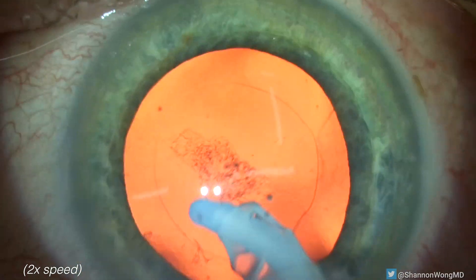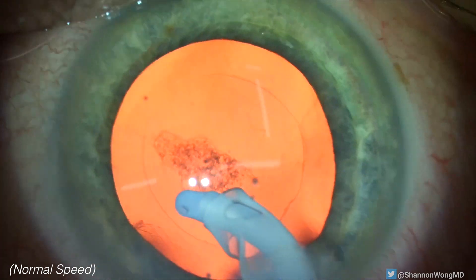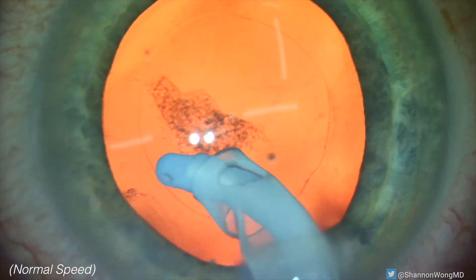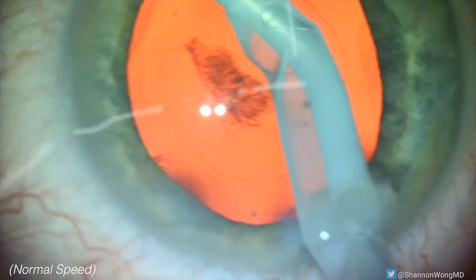Because the tip is made of silicone and not metal, it is soft and pliable and can be used to directly aspirate the lens capsule without breaking it. It's a great instrument.